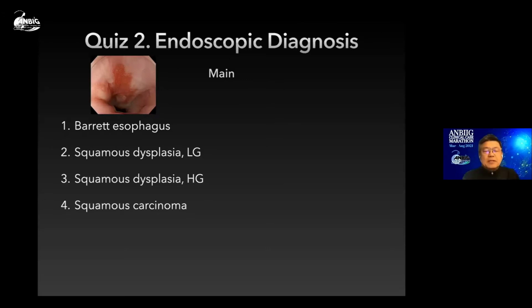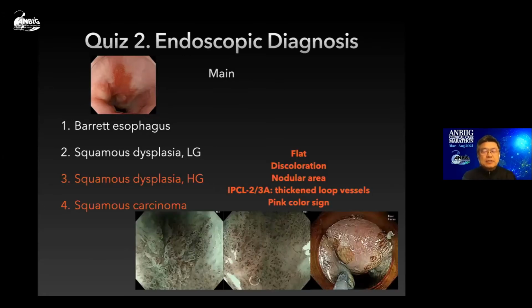Okay, almost 40% of participants chose squamous dysplasia high grade. Yeah. This is my answer. From the pattern of IPCL and the pink color sign after Lugol spray, it means high-grade dysplasia and/or squamous carcinoma.